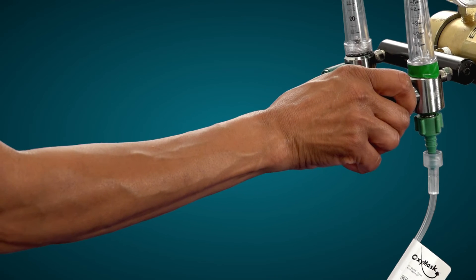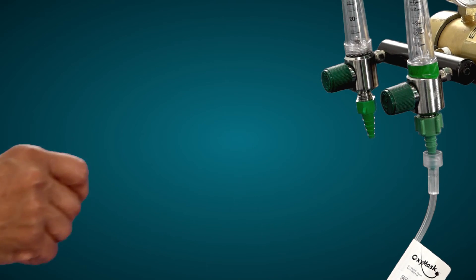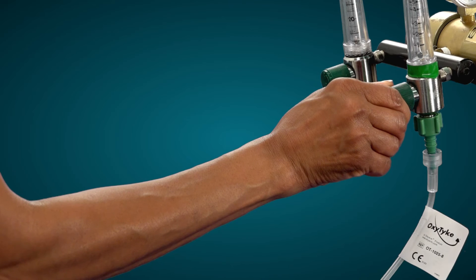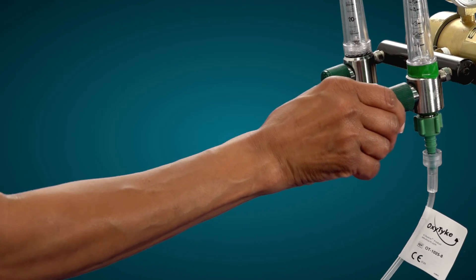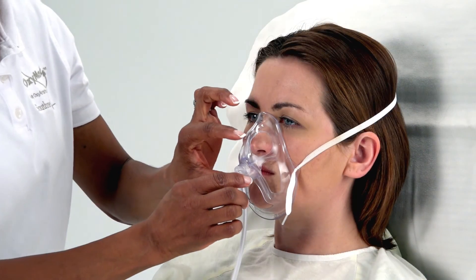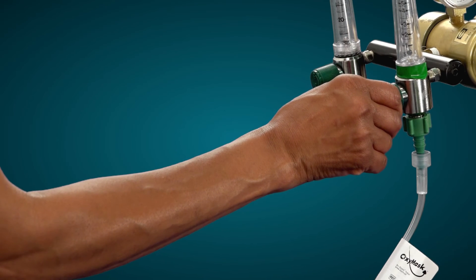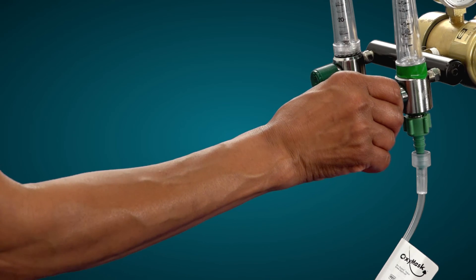Adjust the oxygen flow from 1 to 15 liters per minute or to flush flows. If using the OxyMask Tyke, adjust the flow from 0.25 to 5 plus liters per minute to achieve the prescribed patient oxygen saturation. The tubing on the mask can be adjusted at the swivel to relieve twisting or torque. Allow the patient to stabilize and assess. If necessary, adjust the oxygen flow rate to achieve or maintain the prescribed oxygen saturation. As with all patients receiving oxygen therapy, please contact the physician or respiratory therapist for any acute patient change or as per your organizational policy.